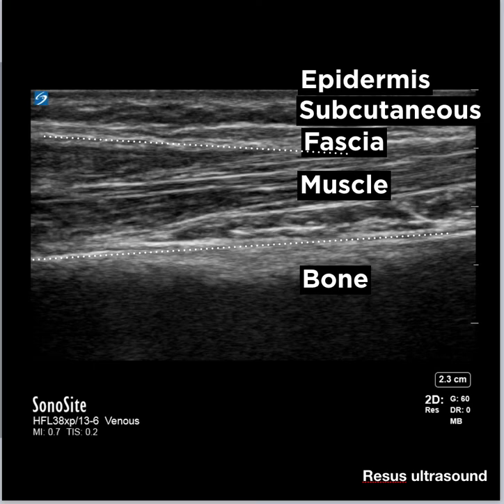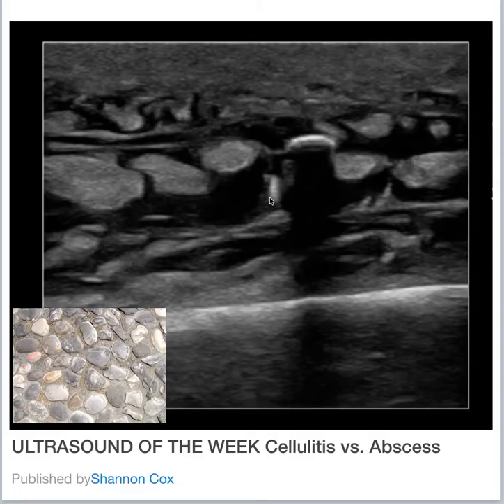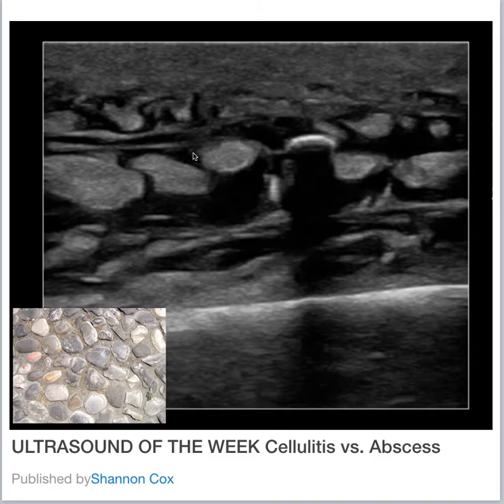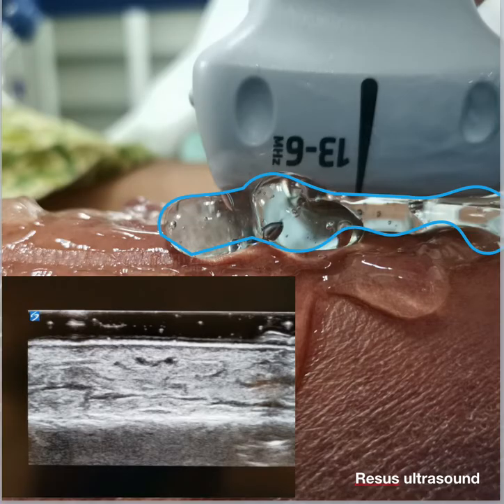In patients with cellulitis, you would see a cobblestone appearance — subcutaneous tissue floating around with fluid in black color. An important point: you have to put a lot of gel on the patient's skin and not press the probe, otherwise you would obscure the fluid.